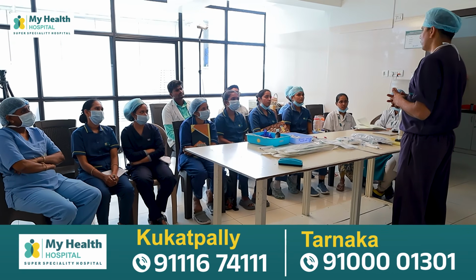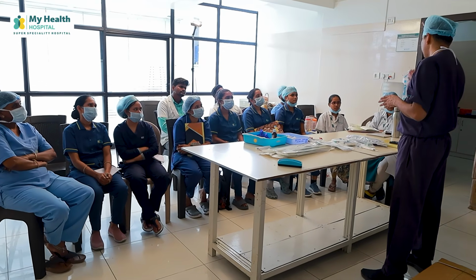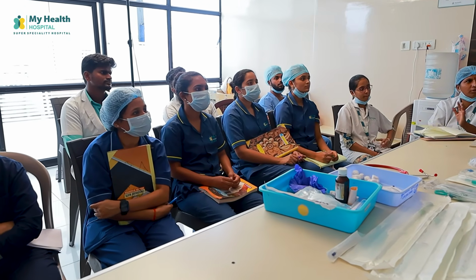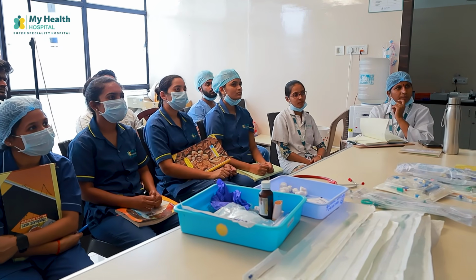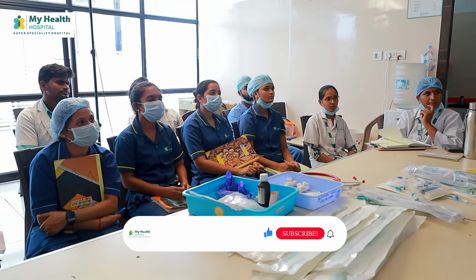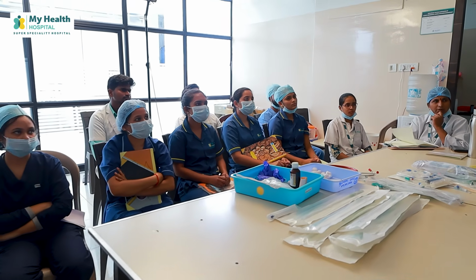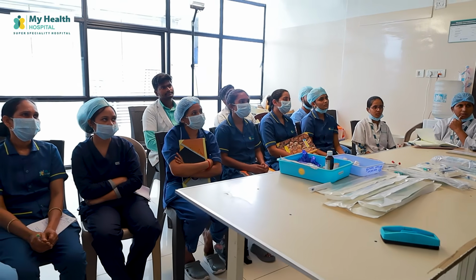Okay, if you have got around 20 ml, what do you do? If you get 70 ml, what do you do? If you get 50 ml, what do you do? Continue the feeds, early feeds. 20 above means we stop. No. When you aspirate after 2 hours, if it is more than 50% of what you have given, it is a reflux. If you are able to aspirate, you don't continue the feed. You wait for 1 more hour and aspirate. Even after 1 hour, if it is the same, you don't give it again.